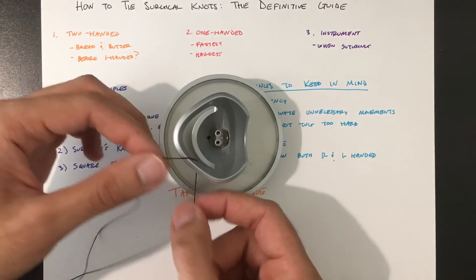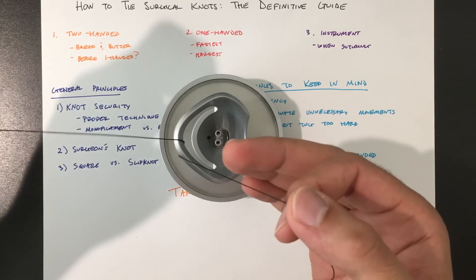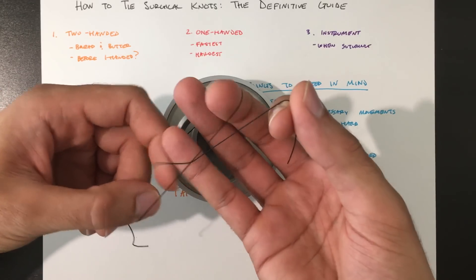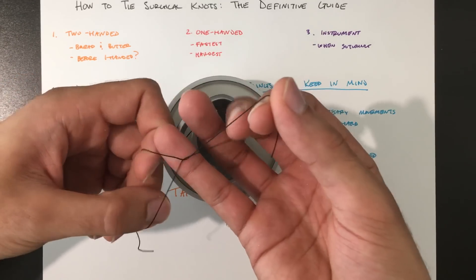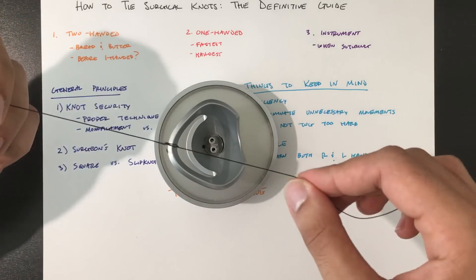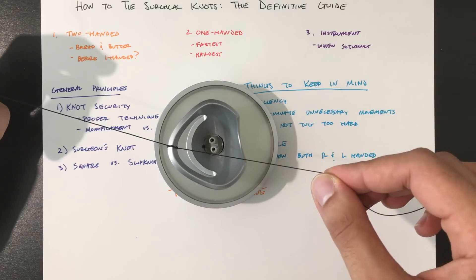So grab your suture, again I like to criss-cross it like so, so it goes down square, book with the right hand, gun with the left, and there you go.